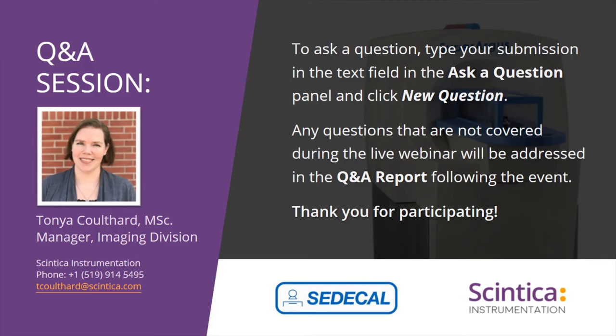All right, excellent answer. Next one here, what radioisotopes can be used with the Sedecal system? For sure, like all PET systems, your standard radioisotopes can be used. So things like fluorine-18, carbon-11, and oxygen-15. But what's most important is to consider the half-life of these agents when you're considering the logistics of your study.